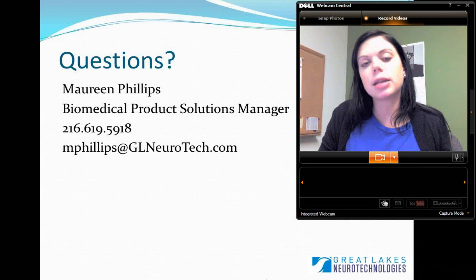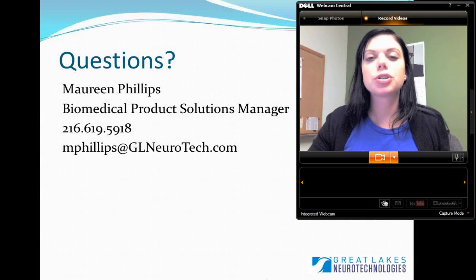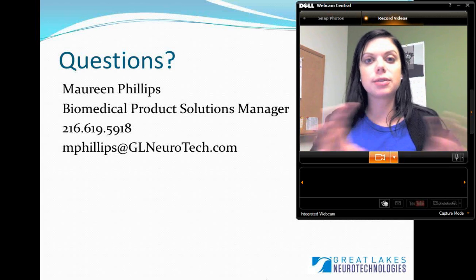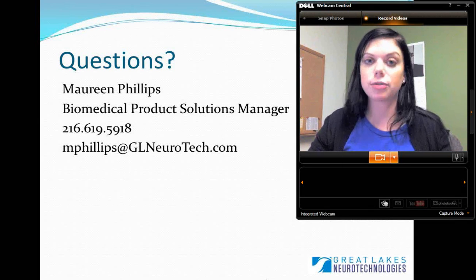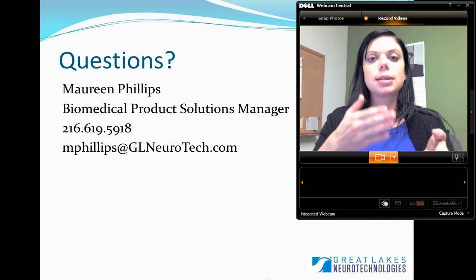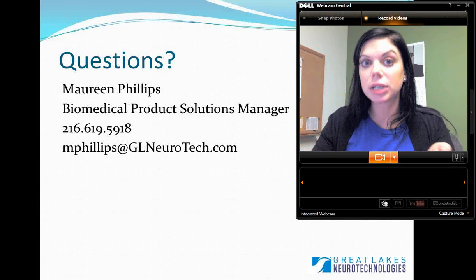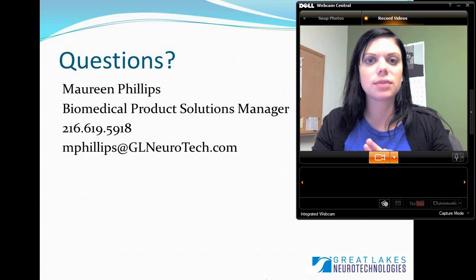The type of waveforms that you extract are dependent on what's going on in the brain at that time. In my previous slides I mentioned that different waveforms occur in different regions of the brain commonly, but that doesn't mean that they can't occur or be extracted from other areas. If you have electrodes placed in the occipital lobe, you would be able to extract those different waveforms as somebody moves through different stages of alertness.